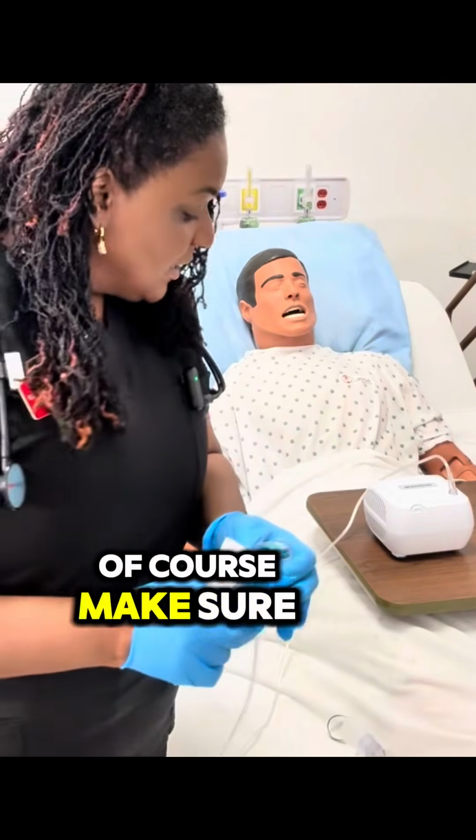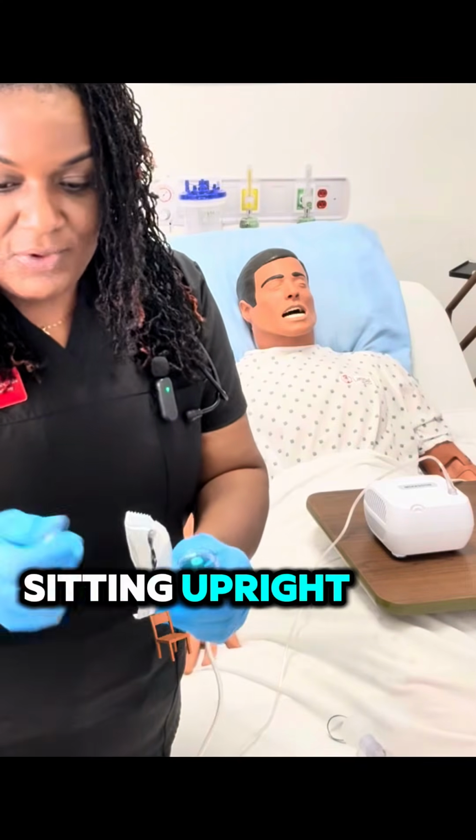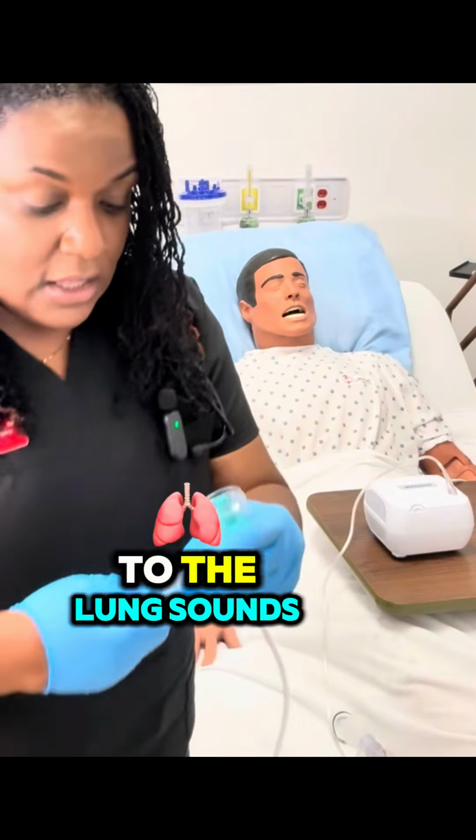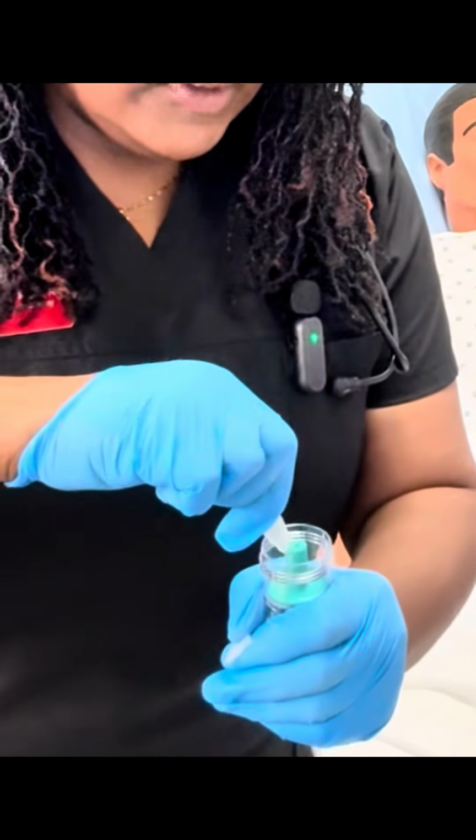Of course, make sure that you have already assessed your patient, that you have them sitting upright, that you have listened to the lung sounds, you've auscultated anteriorly and posteriorly.